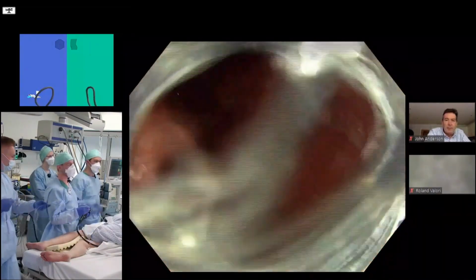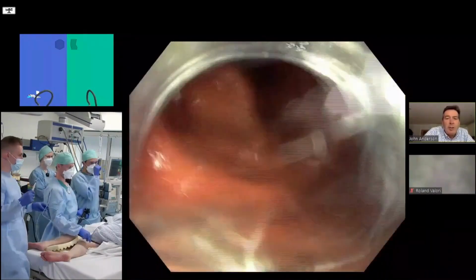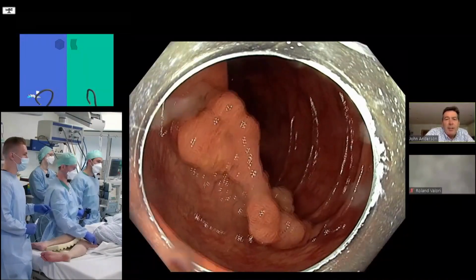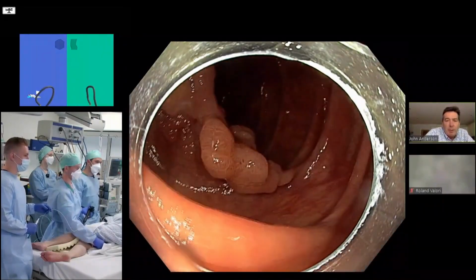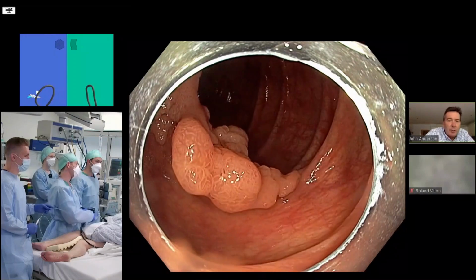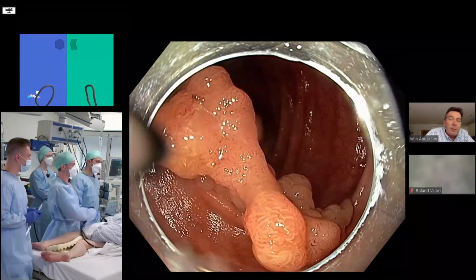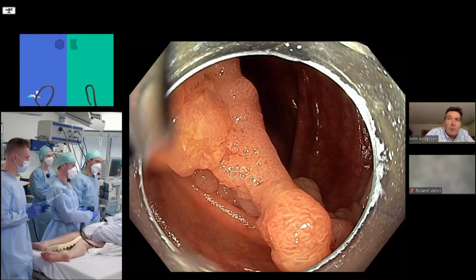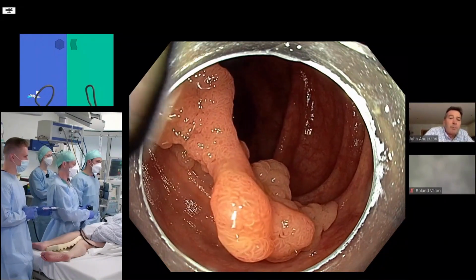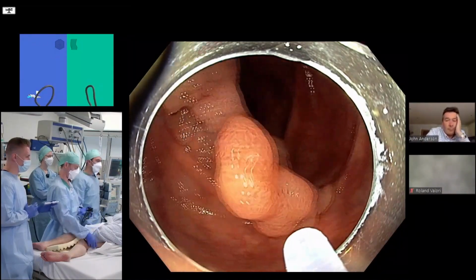Try and get this fluid out first, maybe. David, it's probably worth mentioning gravity's down at the bottom. So unless you're going to move the patient again, starting at the bottom is probably a good idea. So the polyp pieces fall down around your feet and not into where you're cutting next. And also you can then follow the V up the resection margin from 6 to 12 o'clock. So I'd probably start at the bottom. And I think you can choose whether you start here or in that depression.